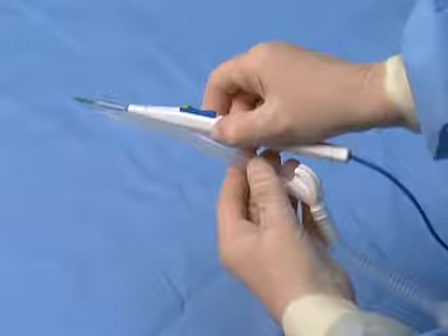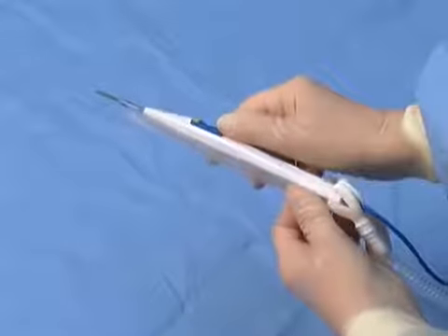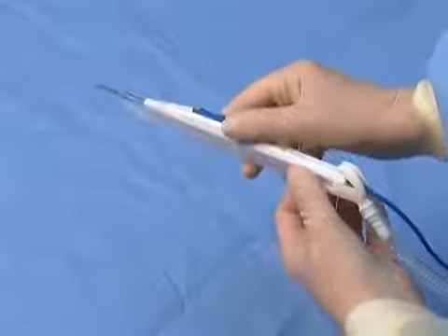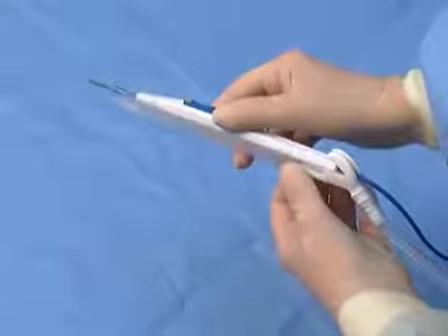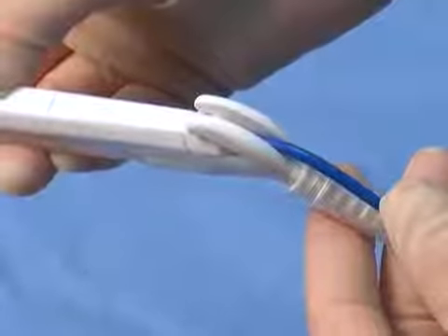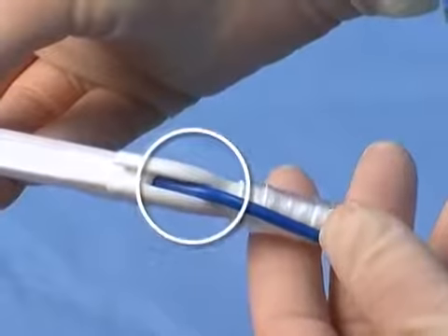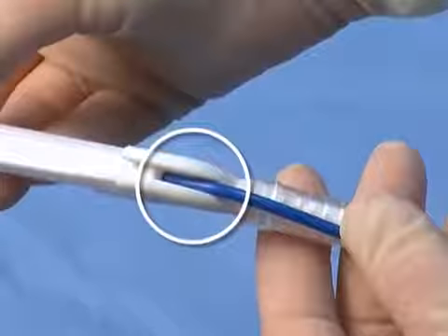While holding the pencil in one hand and the PenAdapt in the other, stretch the PenAdapt until the clasp on the back of the adapter fits over the back end piece of the pencil. Ensure that the wire stemming from the back of the electrosurgical pencil is positioned between the two legs of the PenAdapt clasp, such that the wire is not being pinched or trapped beneath one of the legs.